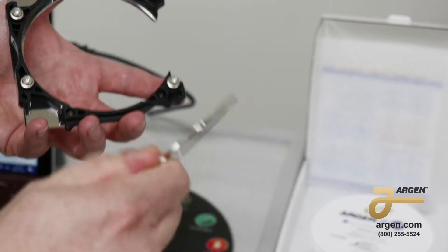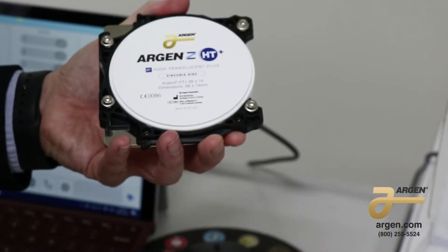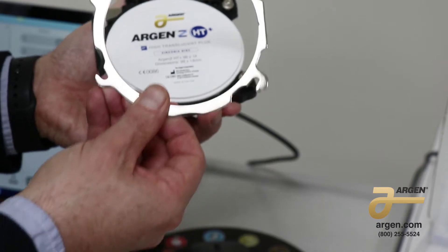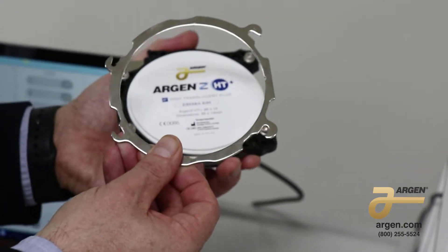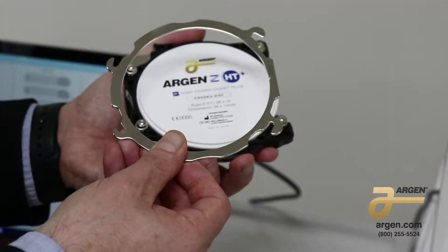This will slide out. You will place the zirconia disc into this adapter, making sure that it's secure. You can see on the far right of the ring is a little notch, and that's where it has to stay.